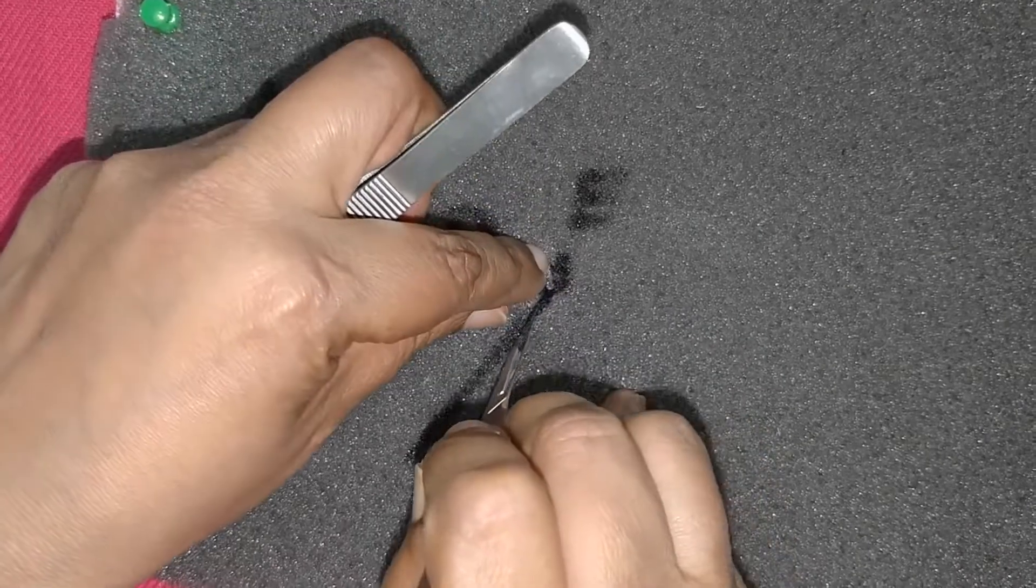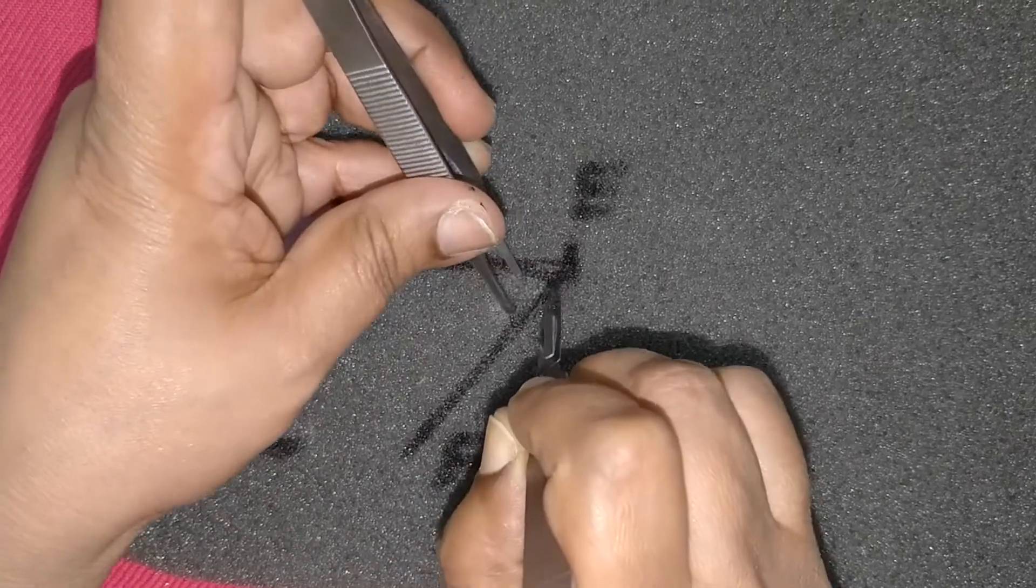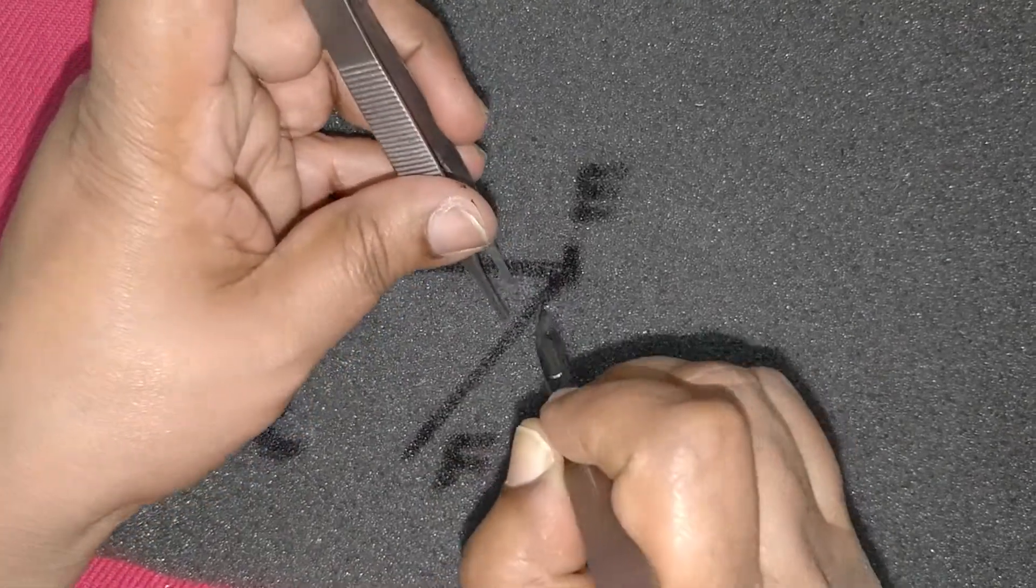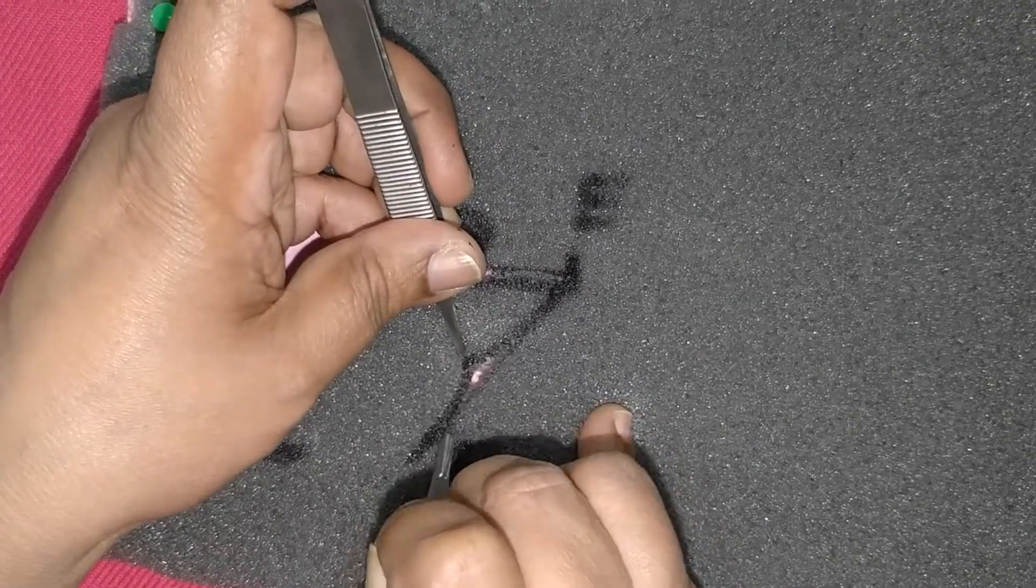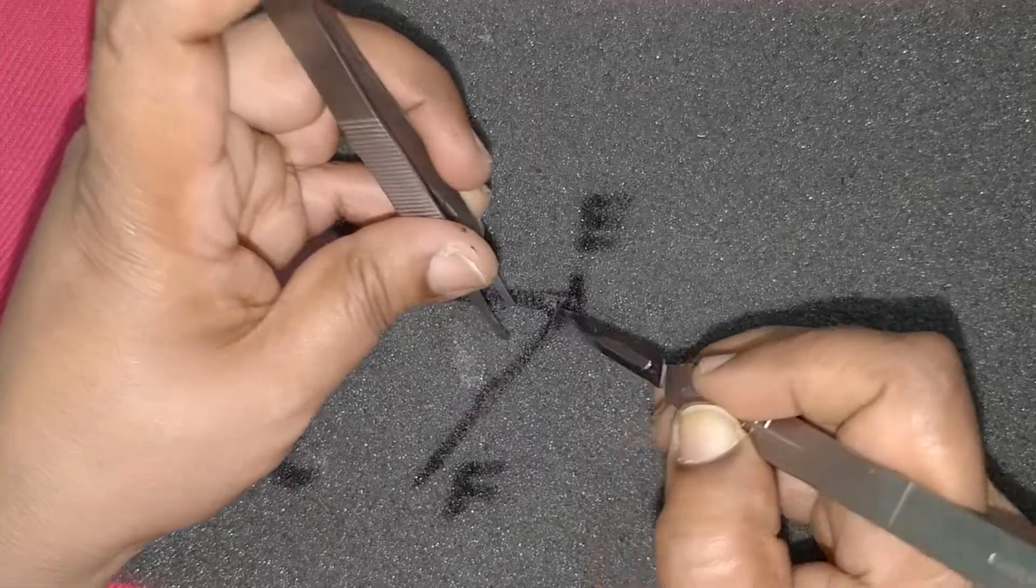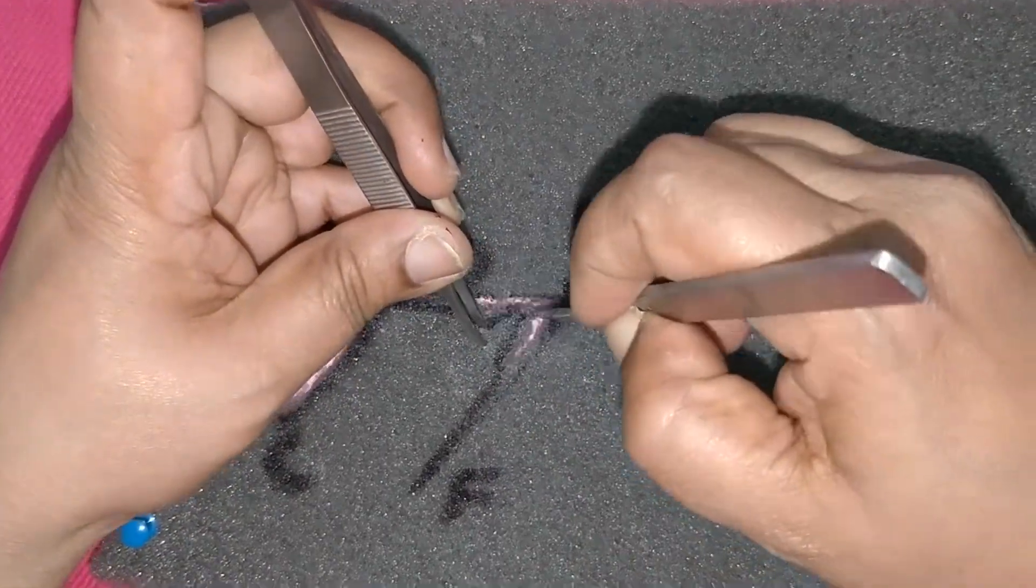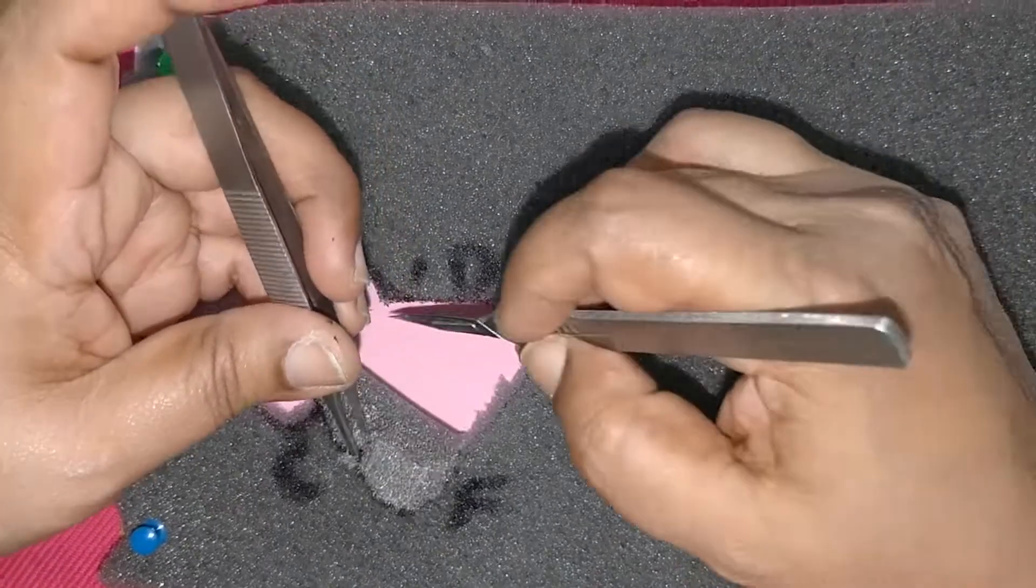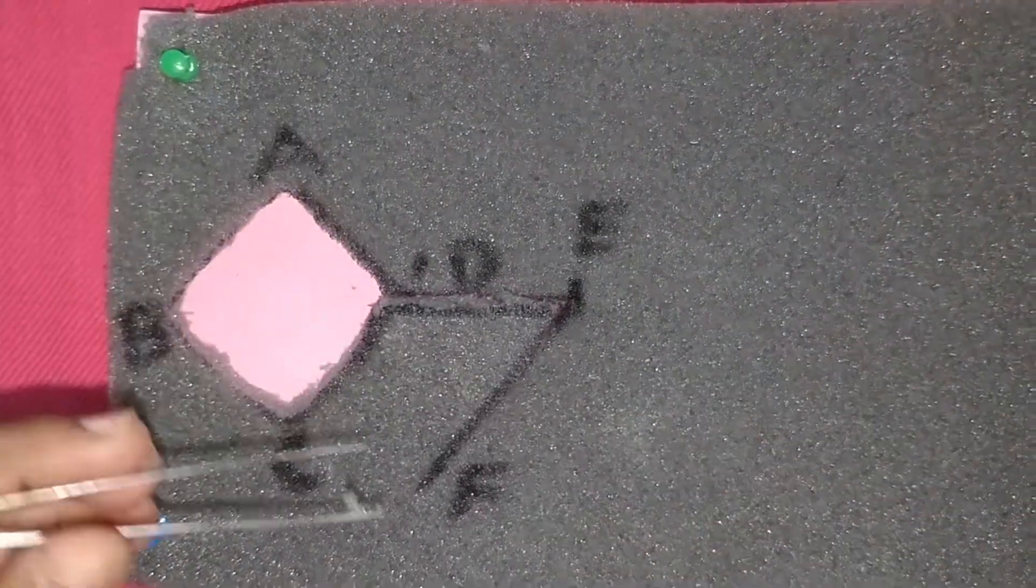The flap is incised. Here the foam is incised. This incision usually goes down to the subcutaneous tissue. Here we have kept a pink background, a thinner layer of foam underneath to show that the appropriate level has been reached.